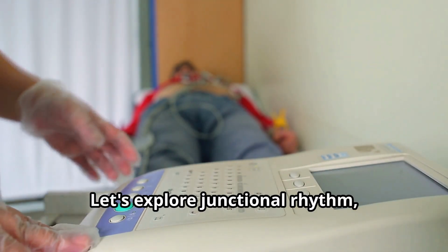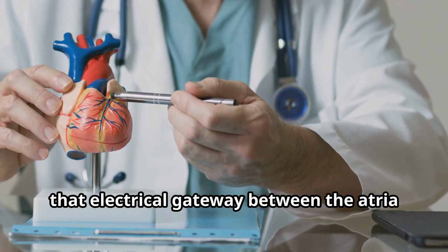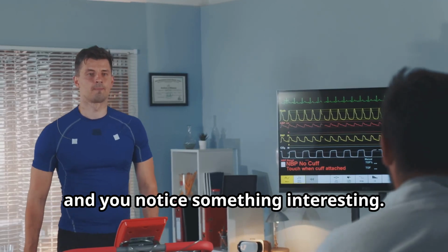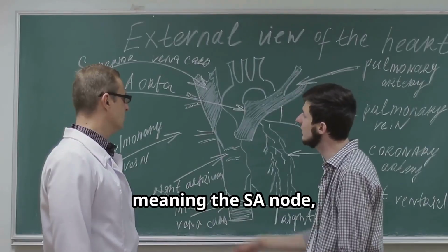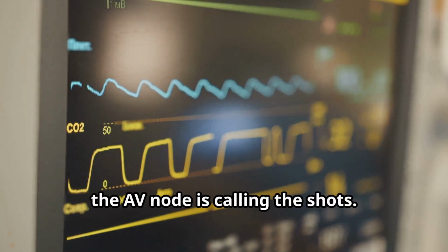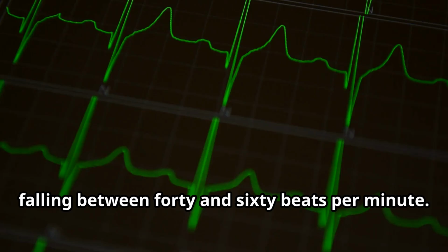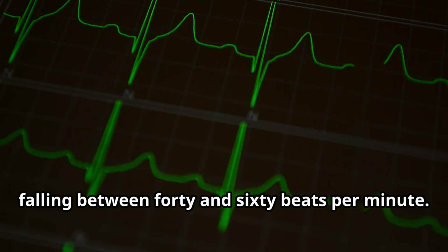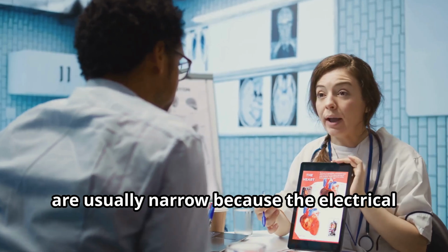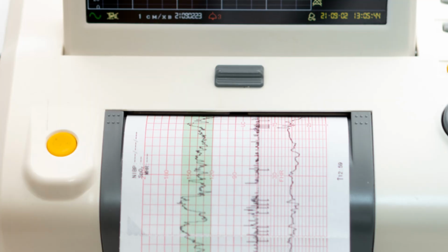Let's explore junctional rhythm, a heart rhythm that originates in the AV node, that electrical gateway between the atria and the ventricles. Imagine this, you're analyzing an ECG and you notice something interesting. The P waves are absent, meaning the SA node, the heart's natural pacemaker, isn't initiating the heartbeat. Instead, the AV node is calling the shots. The heart rate in junctional rhythm is typically slower, falling between 40 and 60 beats per minute. And the QRS complexes, which represent ventricular depolarization, are usually narrow because the electrical impulse is traveling down the heart's normal conduction pathway.